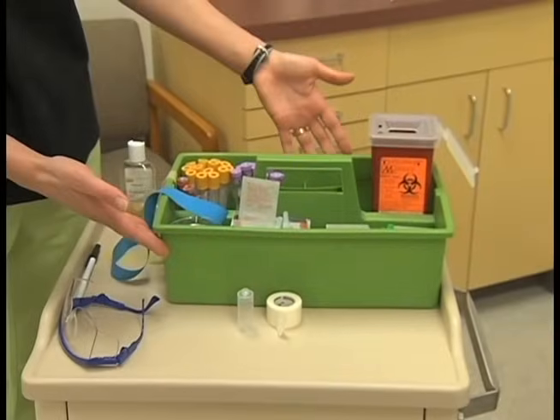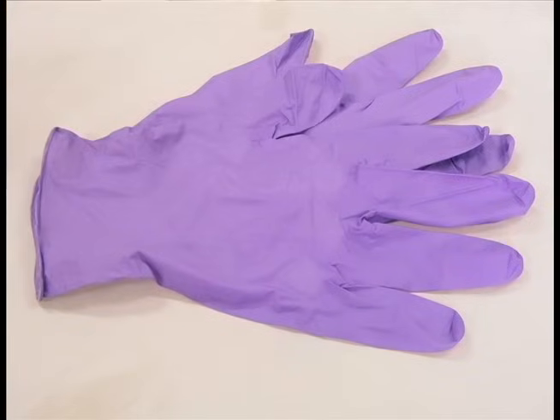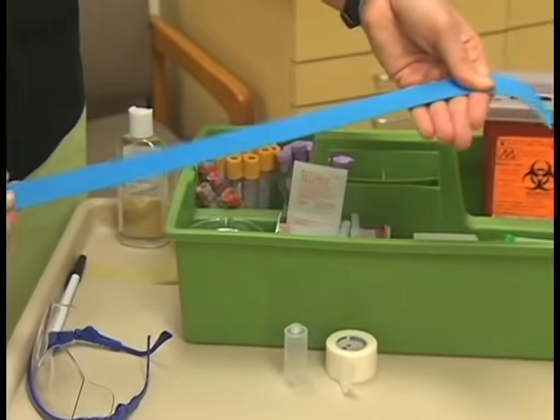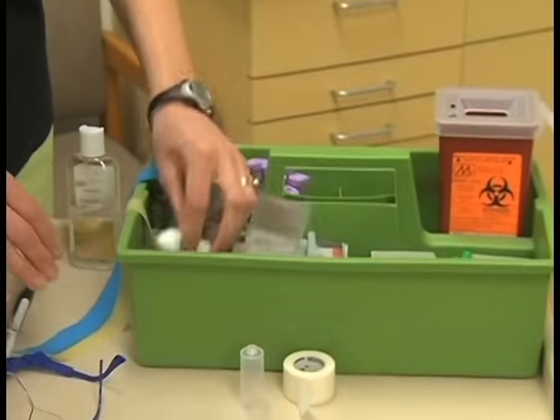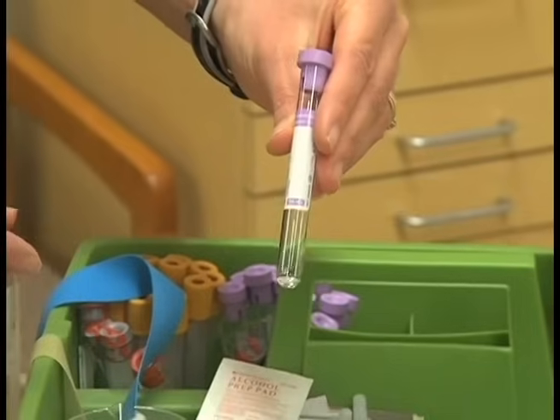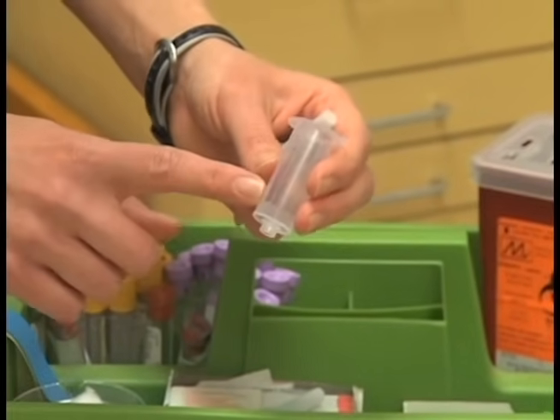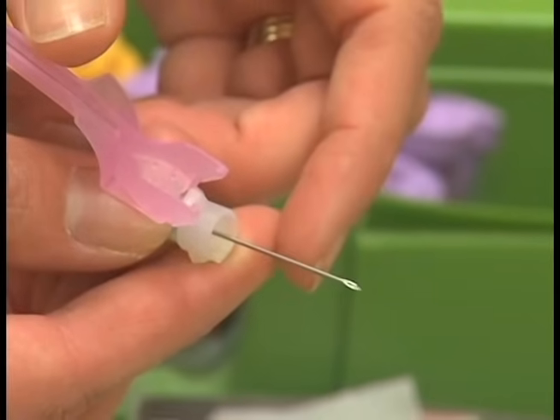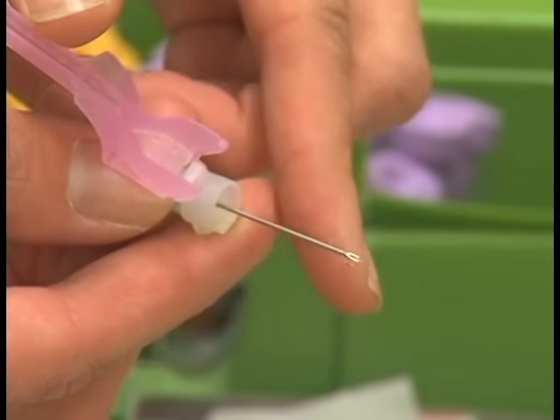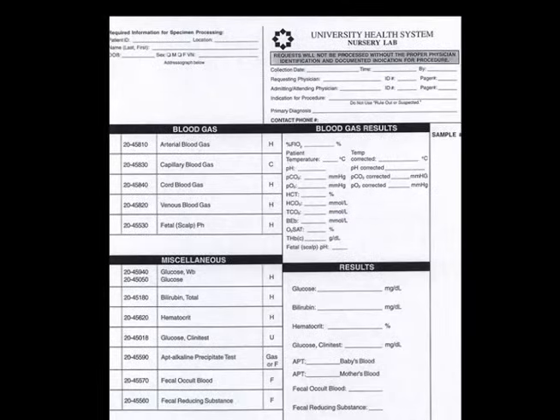Here are the supplies needed for venipuncture with the vacuum tube method: disposable gloves, tourniquet, safety glasses, adhesive bandages, cotton balls, antiseptic wipe, evacuator tubes with labels, plastic holder, double-pointed needle, biohazard sharps container, and laboratory requisition form.